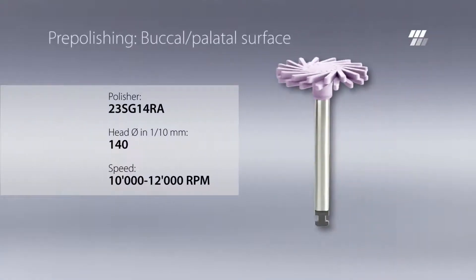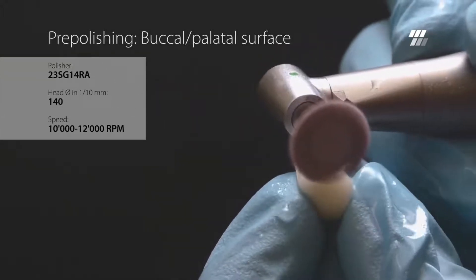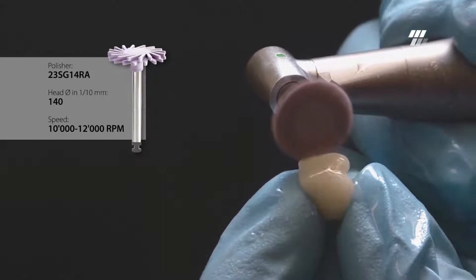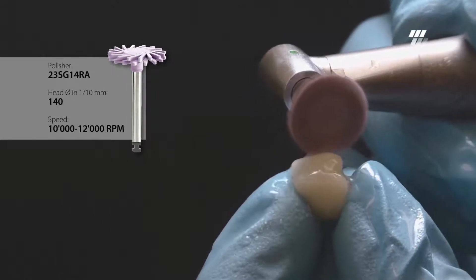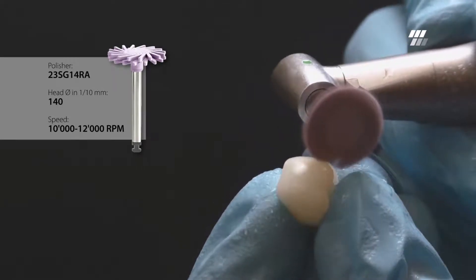Diatek ShapeGuard Purple with a diameter of 14 mm is suitable for buccal and palatal surfaces. Although Diatek ShapeGuard is pressure insensitive and gentle to the composite crown, it is recommended to exert minimal and constant pressure.